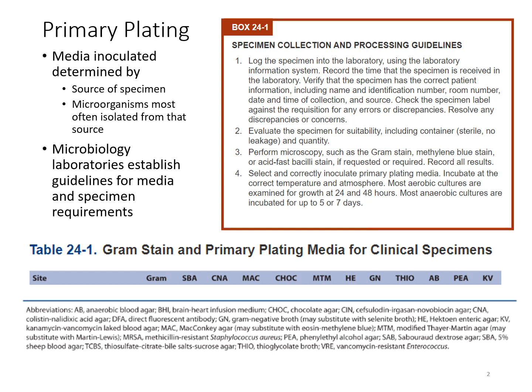So there's a lot of things that you'll have to look at with that sample, and you've got to be familiar with that sample in order to be sure that it is something that you can set up in culture. You may possibly, depending on the sample source, need to perform a direct microscopy of that sample. And so you could do this by something like a gram stain, a methylene blue stain, acid-fast, just whatever your particular facility uses as their way of doing those various stains for that particular culture.